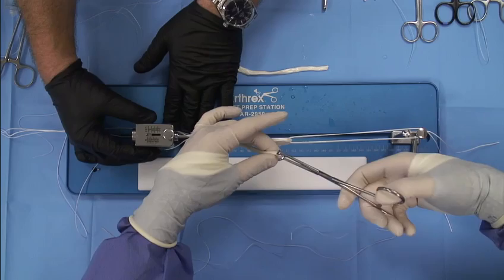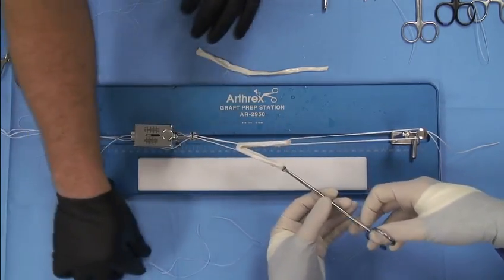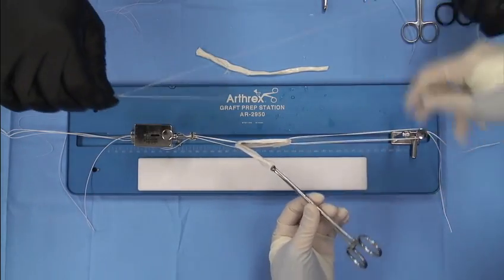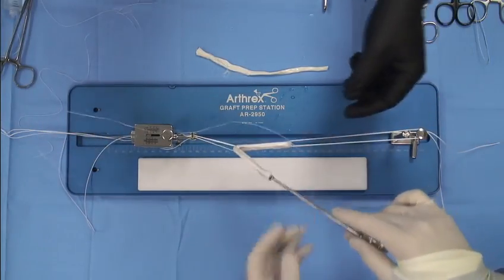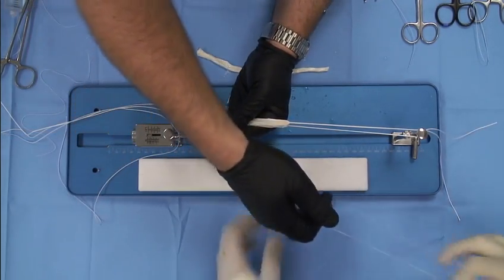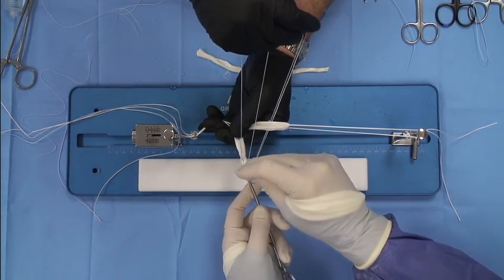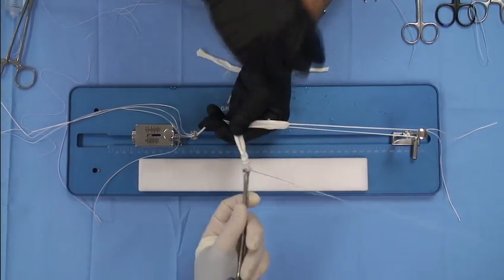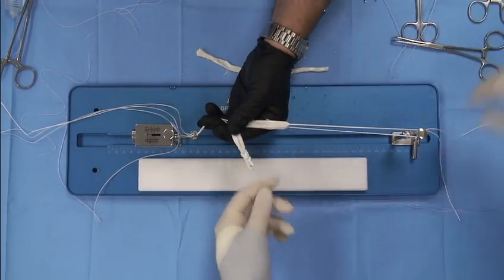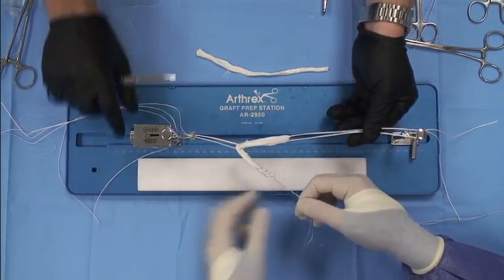You can hold these with an Allis clamp or with a hemostat, but eventually those get in the way. So the best trick is to take a fiber loop and to sew them together. Take out the slack, pass the clamp through the loop, penetrate, pull it through. And now what we can do is take off our Allis clamp, and you can see how that's nicely affixed.